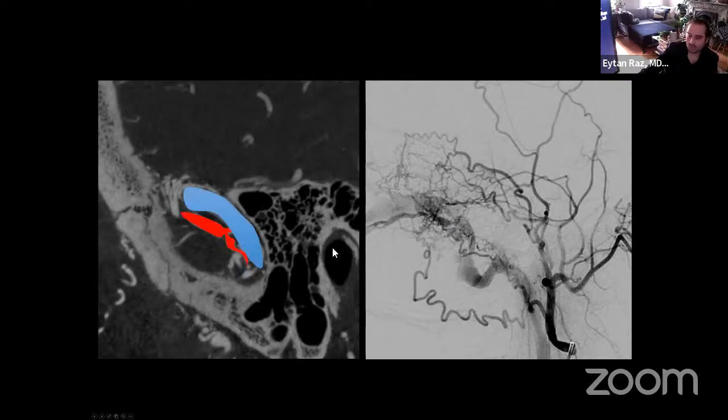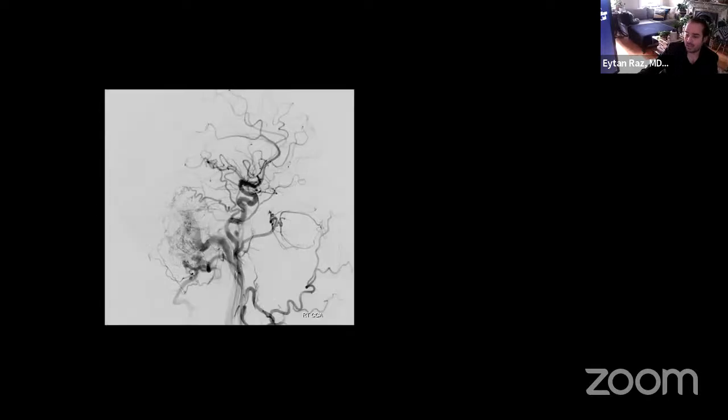How to apply this in practical ways, like with treatment. This is an example. This is a patient who was treated somewhere else, and initially seemed to be occluded, but then recurred and came to us to do a second stage treatment. And you get this 2D DSA, common carotid angiography. There's obviously a fistula, like this. You see this early opacifying sigmoid sinus, internal jugular vein. A lot of arteries going here. You can act on these in many ways. This sinus was needed, so it's better to preserve.